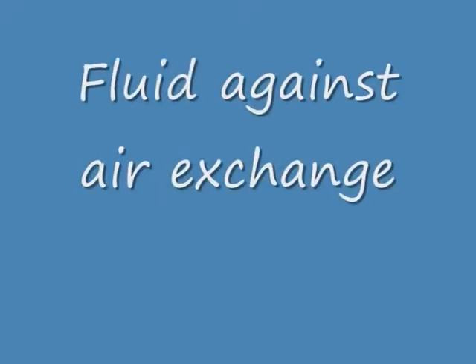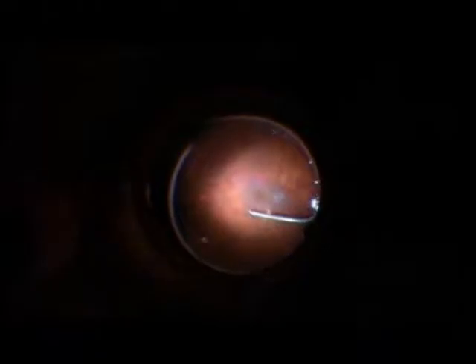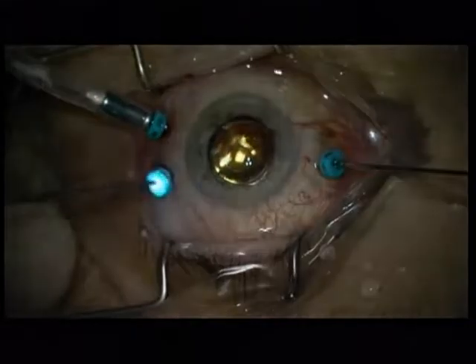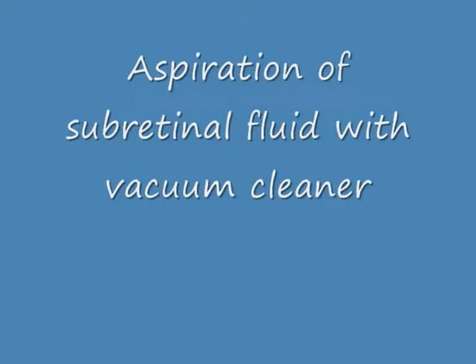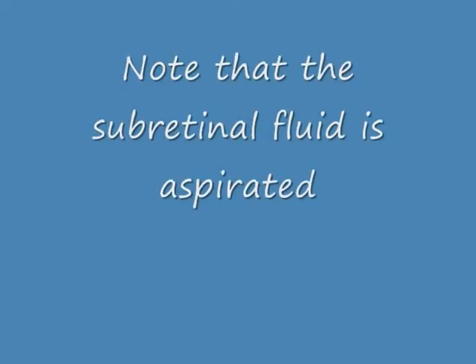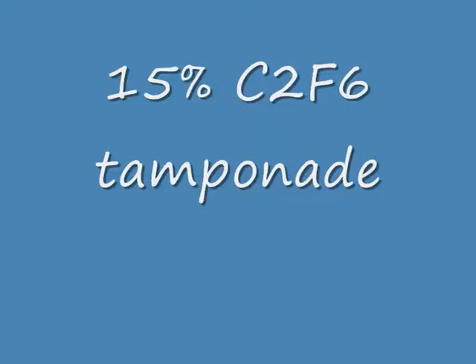Fluid-air exchange, and then a C2F6 gas tamponade. But before doing this, I want to do a thorough removal of subretinal fluid. I'm using a vacuum cleaner — now note how the subretinal fluid disappears. Now it is completely gone. This is a silicone tip vacuum cleaner. Very carefully — now C2F6 tamponade.